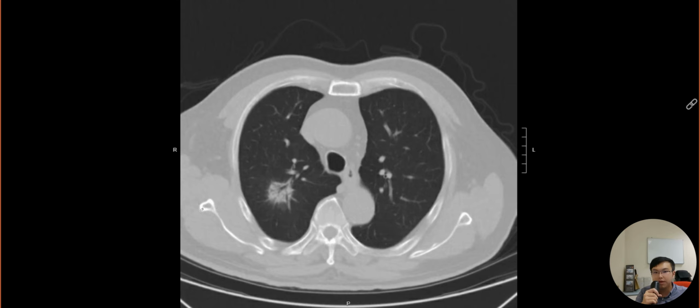Because we have a scapula here, we ask the patient to retract the scapula, and then we expect to see the posterior window become more sizable for us to approach the lesion posteriorly. And for a subsolid lesion, we aim at the solid component rather than the peripheral ground glass component, because this gives a higher chance of a better yield for the pathologist to make the diagnosis for us.